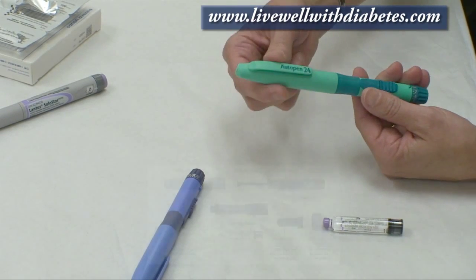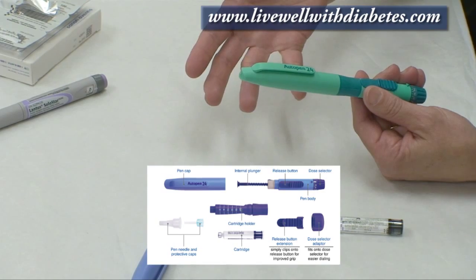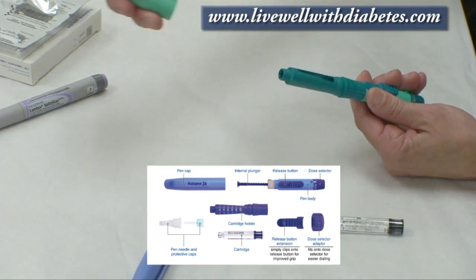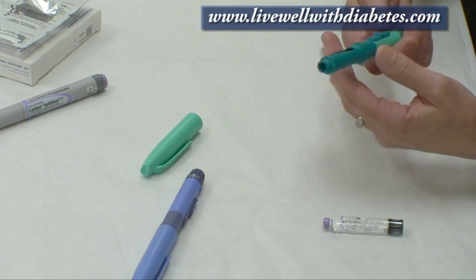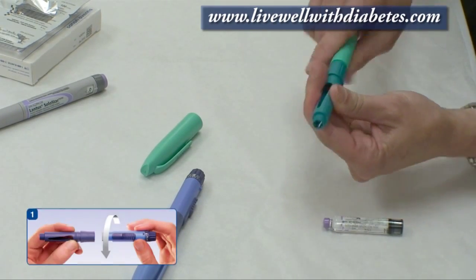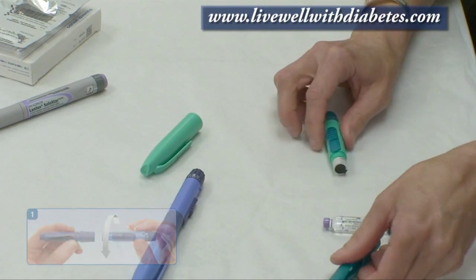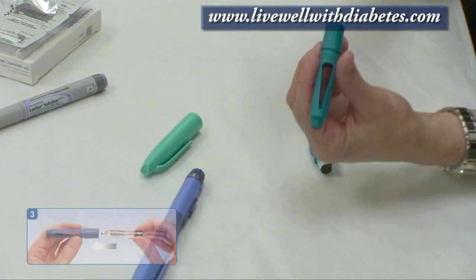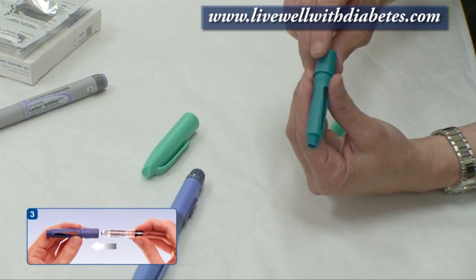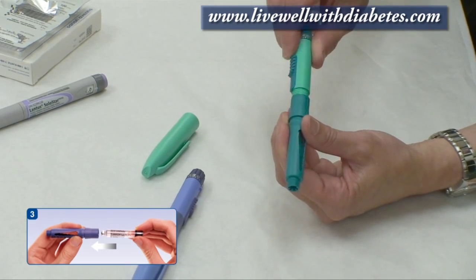This is the Auto Pen 24 and it comes with a cap on it, just like a regular pen. I pull the lid off, and then these two pieces unscrew in the middle — I just hold each side and unscrew them and it comes apart. The insulin tube fits with the purple end into this section, and then I screw the two pieces back together again.